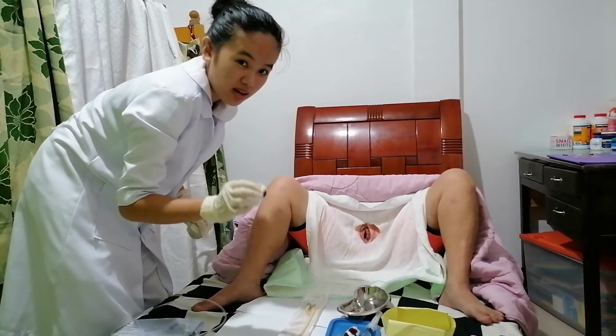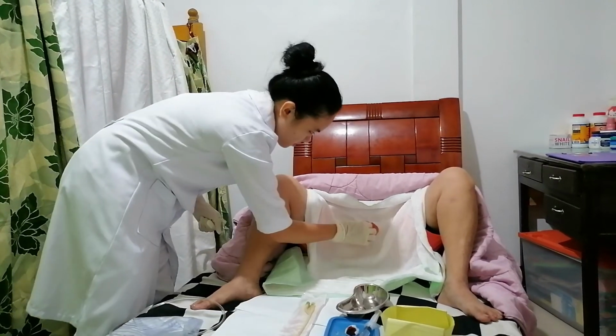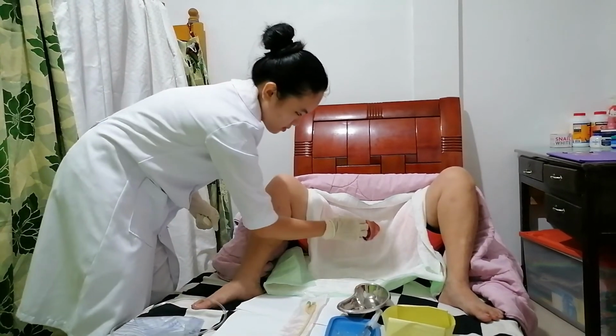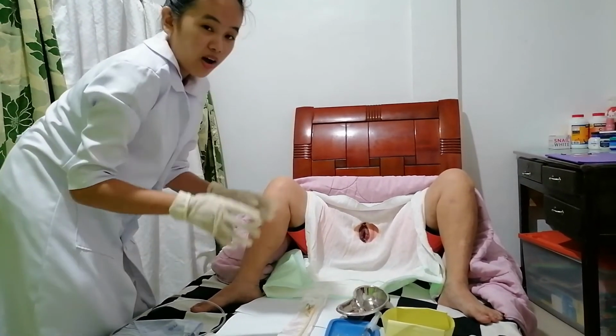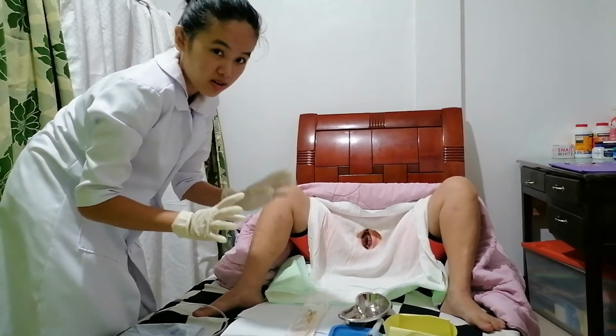So this is one side only. Next. Then discard. Next is into the center. Then discard. After that, I'm going to prepare the catheter into the sterile field.